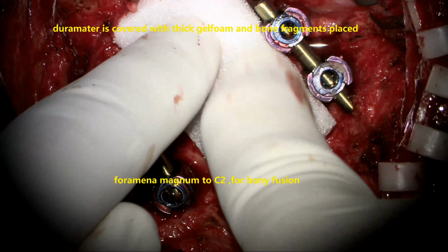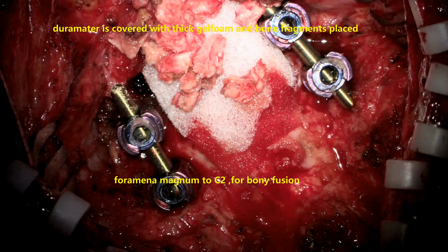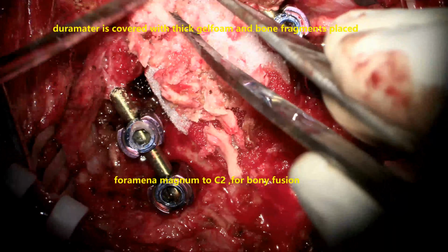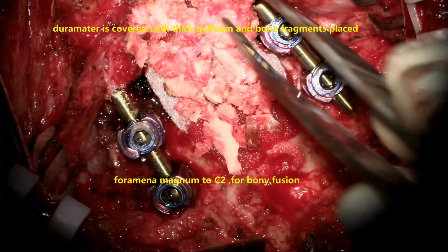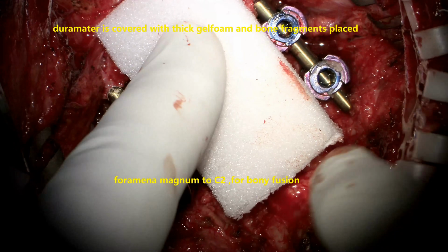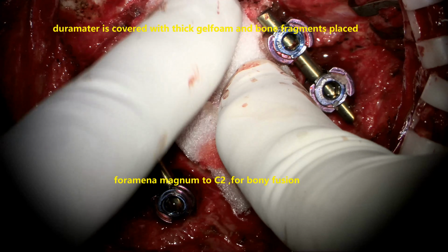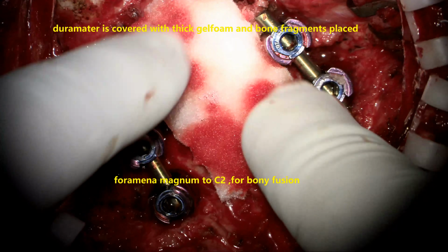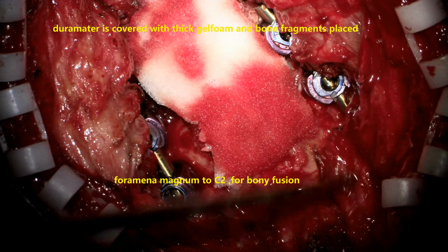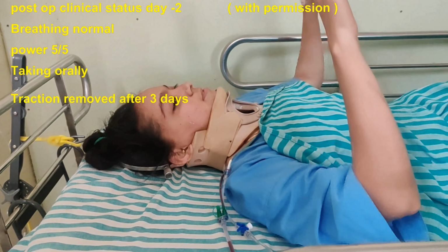We prefer to put a thick gel foam on the dura and spread the bone fragments from the foramen magnum up to C2 and cover them with the gel foam so that they don't get dislodged and help in posterior stabilization subsequently. This is the posteriorly placed bone graft along with lateral mass bone graft fusion with C1, C2 lateral mass fusion with the implants. The muscles are closed in 3 layers over the drain.